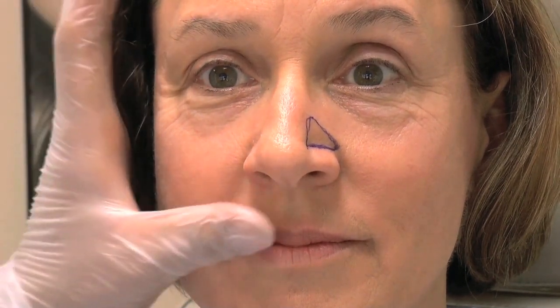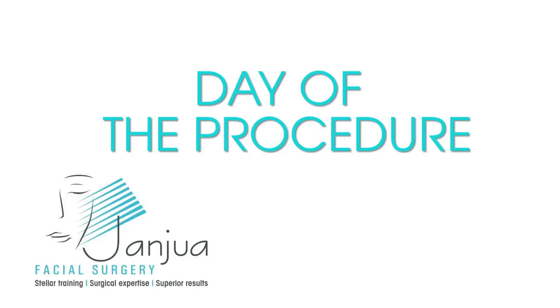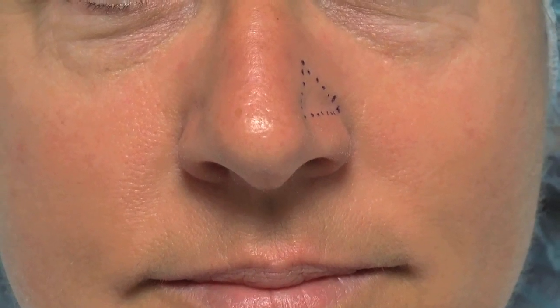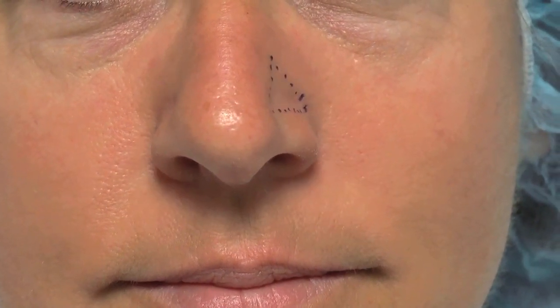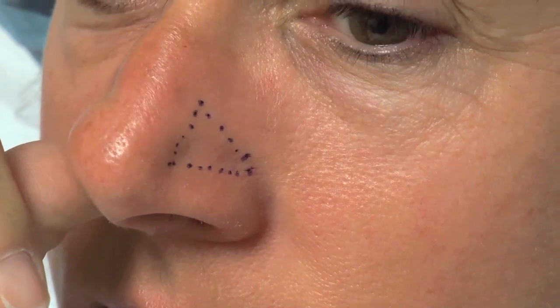And for one last time, I'll ask you to please take a deep breath. Excellent. Great. We have marked the patient in the area of maximal collapse in the left nasal valve. Would you take a deep breath for me, please? Thank you. Take a deep breath, please. Again.